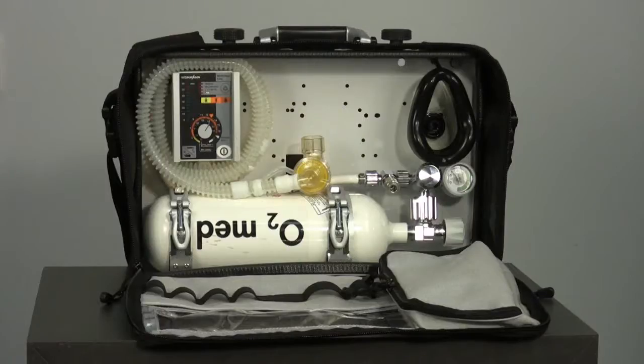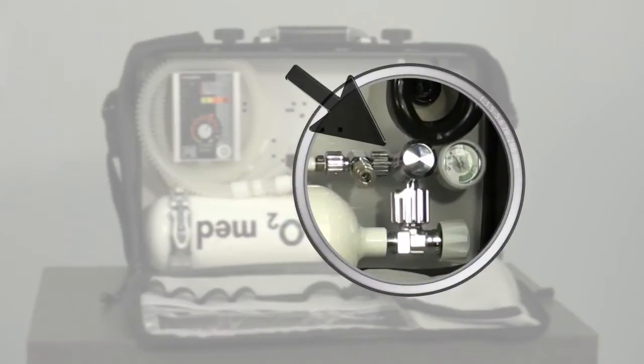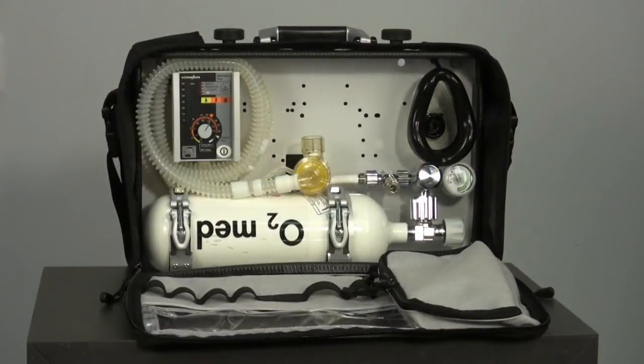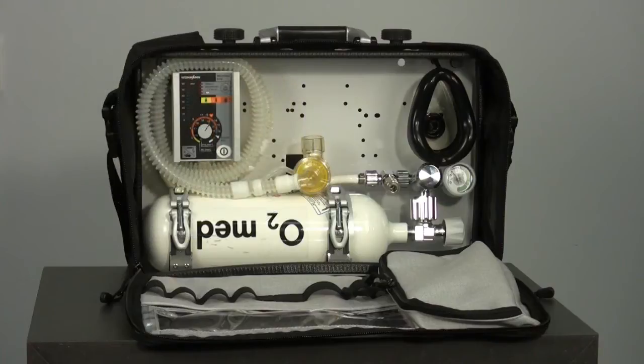The most important components of the portable system LifeBase 3 are: the 2 litre oxygen cylinder, the pressure reducer OxyWay Fix 3, the T-shaped distributor with Walter connector for feeding gas from an external source of oxygen, the pressure hose between Mejumat Easy and the pressure reducer, the Mejumat Easy ventilator, the patient hose system on Mejumat Easy, and the ventilation mask.